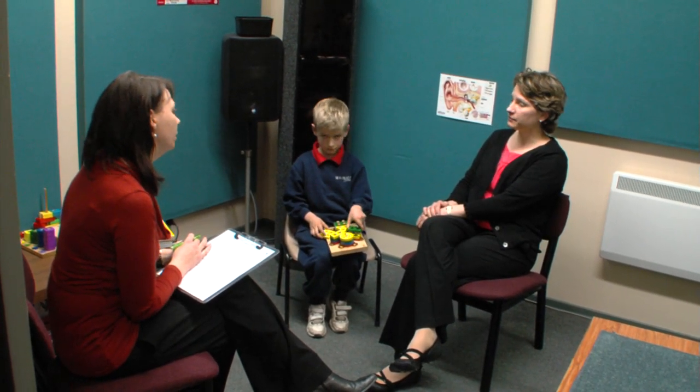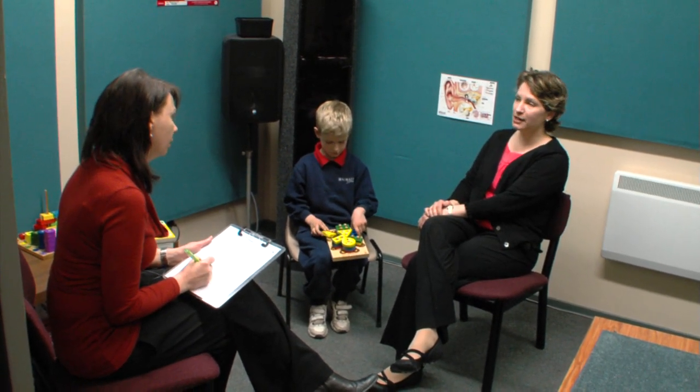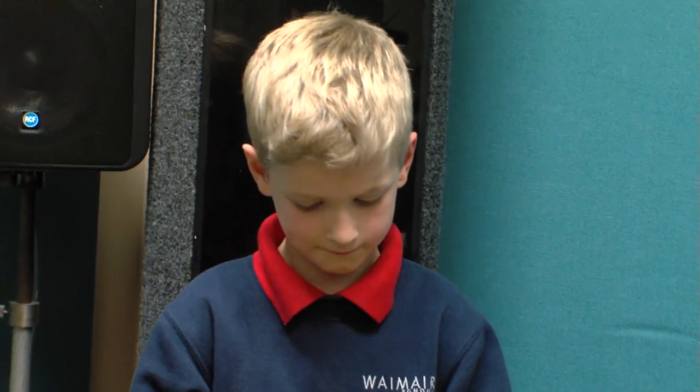When taking a history for a child client, the majority of the questions are aimed at the parent or the caregiver. The audiologist will ask about the parent's view of the child's hearing, pregnancy and birth history, speech and language development, developmental milestones, and ear health history.